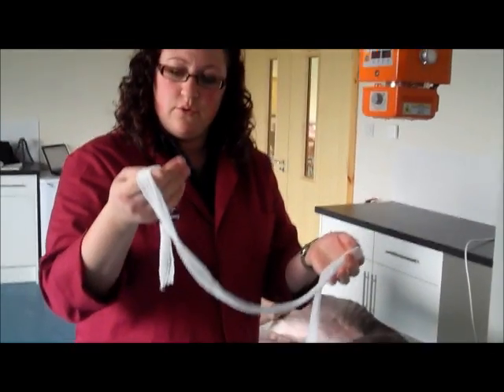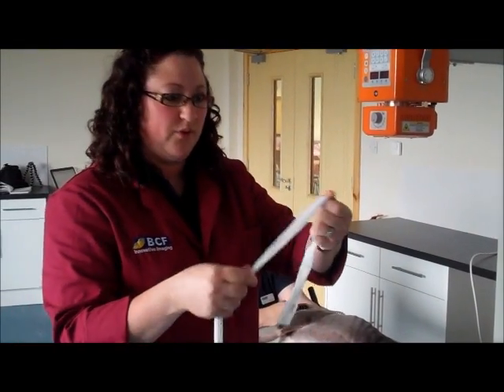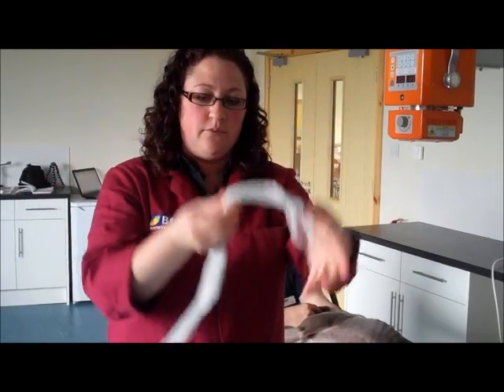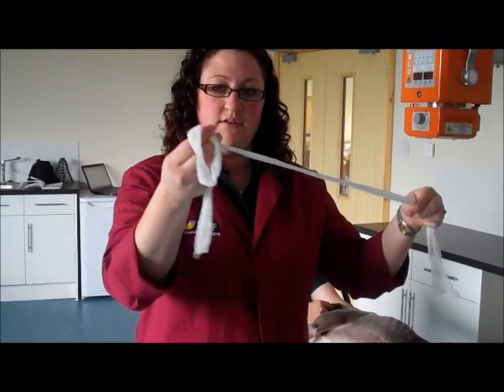First off, what you can do with the gauze is actually make a loop out of it — a running noose — so we can make it looser and then tighten it up. I'll make two of those.